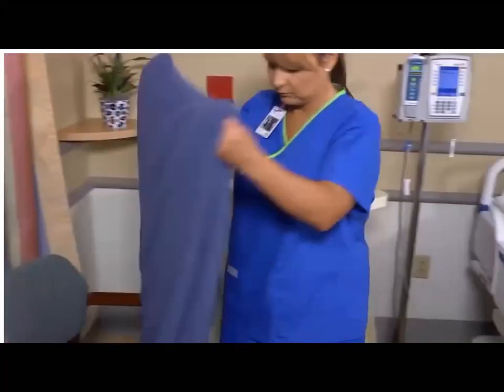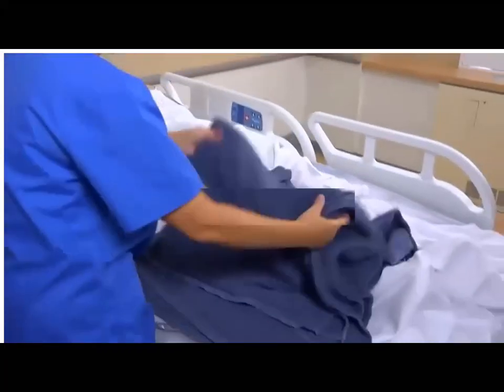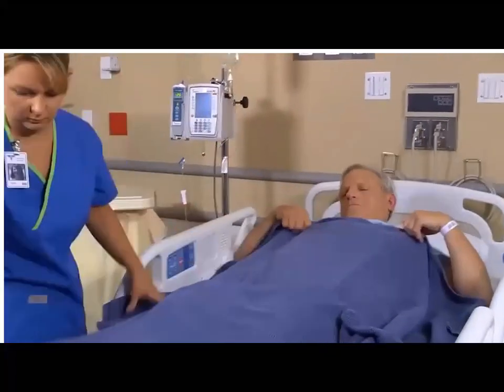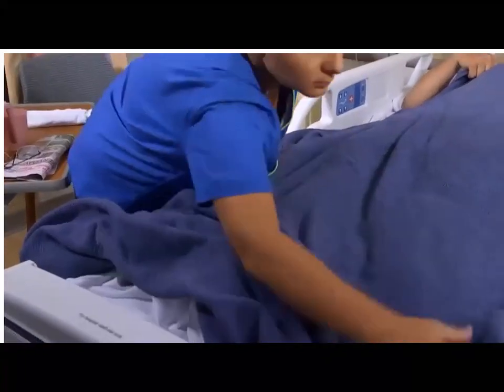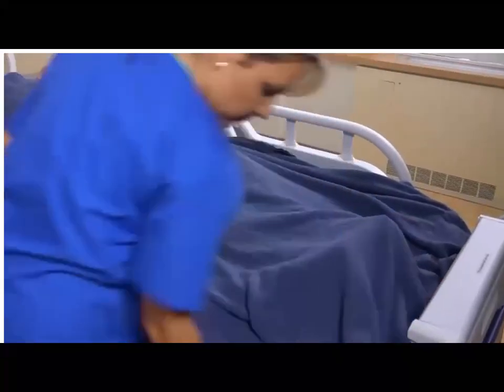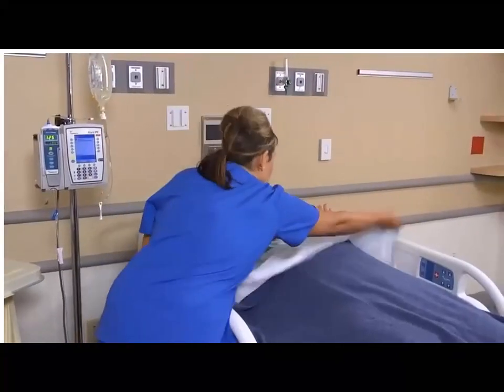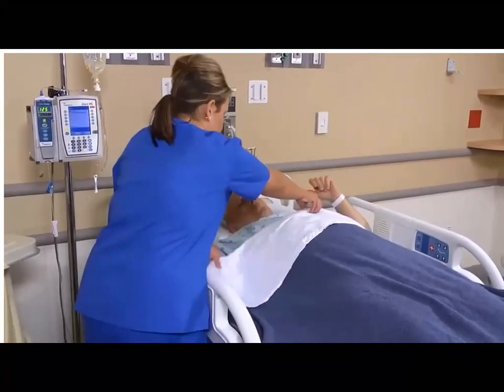Place a clean or reused bed blanket over the patient. Make sure the top edge of the blanket is parallel with the top edge of the sheet and about 15 or 20 centimeters, that's 6 to 8 inches, from the edge of the top sheet. On the other side of the bed, spread out the sheet and blanket evenly. Then make a cuff by turning the edge of the top sheet down over the top edge of the blanket.